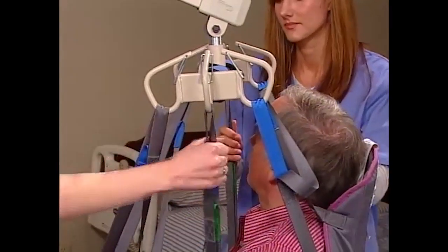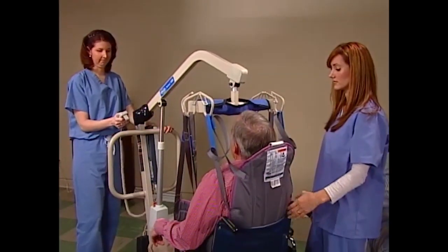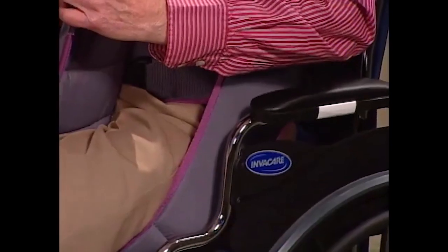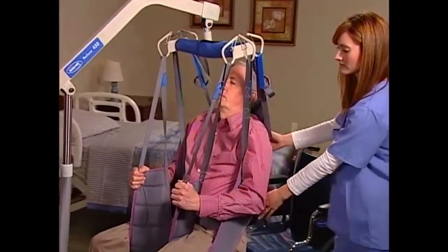Double check to make sure that all sling straps are properly attached to the swivel bar. If they are not, lower the sling and fix them. Start the transfer. Press the up button on the hand pendant until the resident rises to a point just above the wheelchair. During the transfer, the other caregiver can use the sling handles to maneuver the resident.